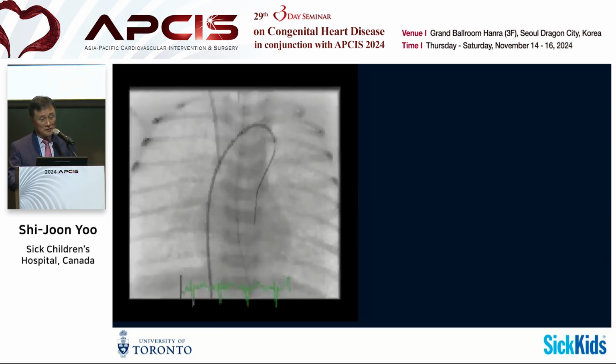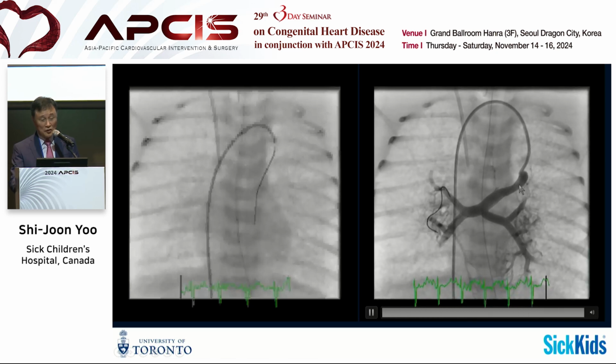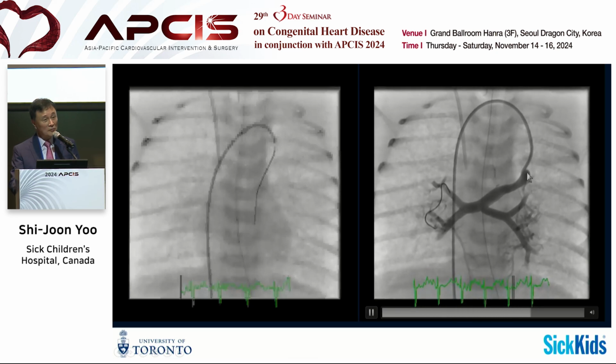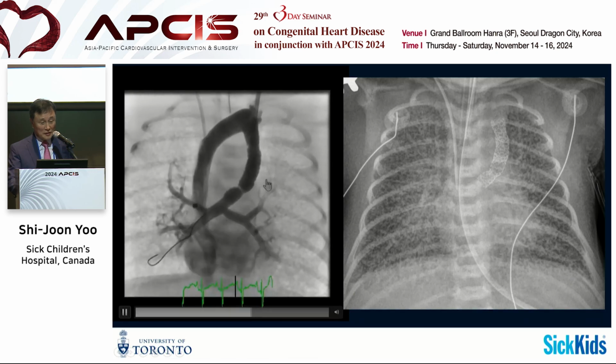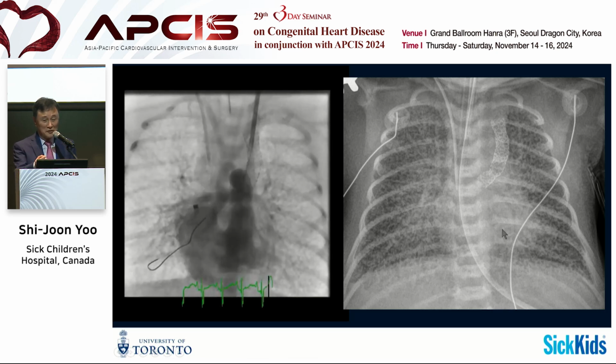Okay. So this is a case of obstructive TAPVC. You can see that the retrograde catheter goes through the brachiocephalic vein and the vertical vein and comes into the common pulmonary vein, where you can see almost complete obstruction. So it is stented, successfully stented. I will show you the chest X-ray here because we didn't have a better chest X-ray before.